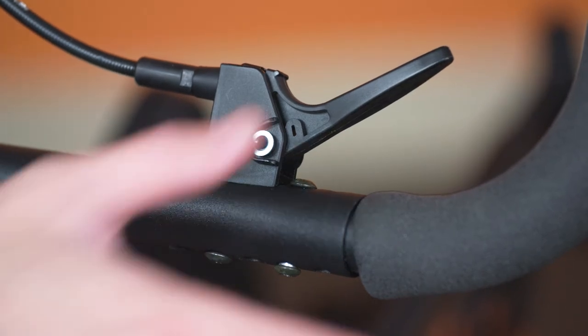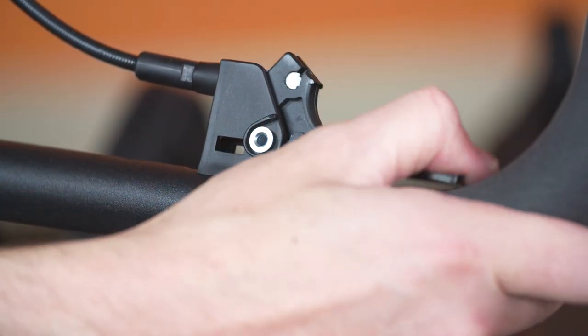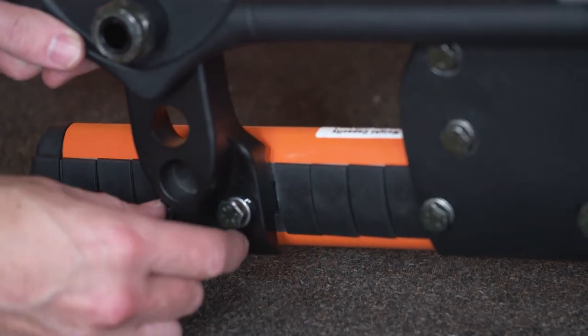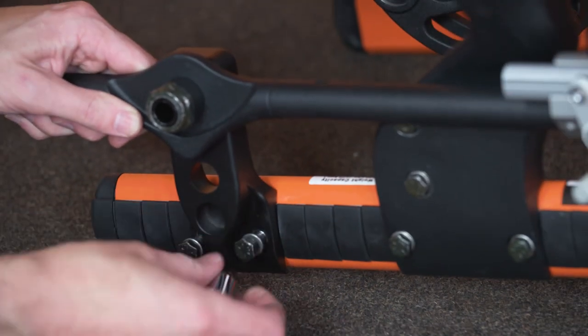Check trigger travel, and if necessary, adjust the cable turnbuckle. Triggers should have a small amount of free play when fully released. Reinstall the axle plate and torque the fasteners to specification.